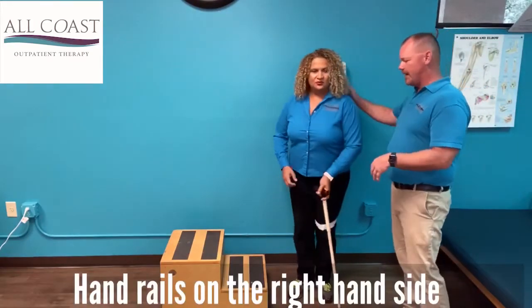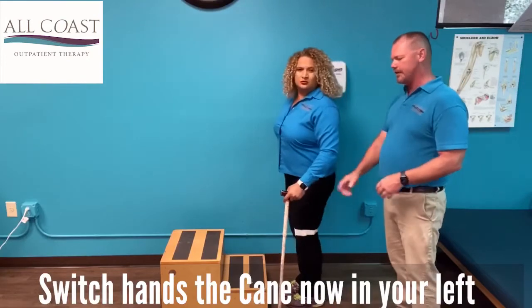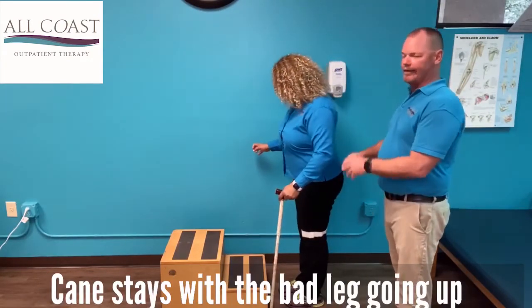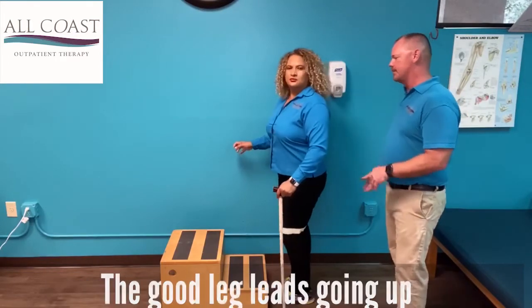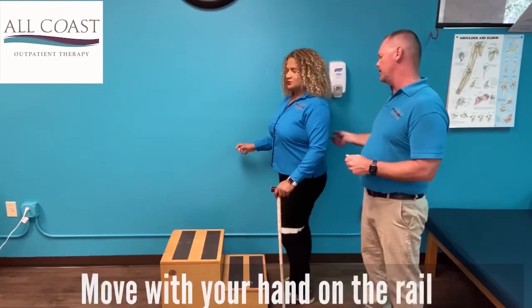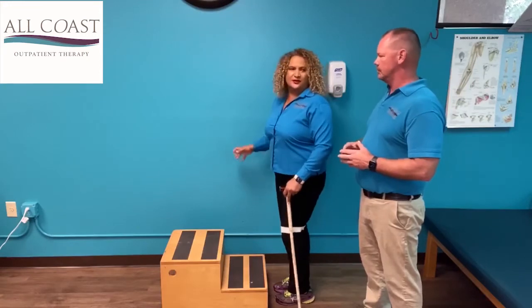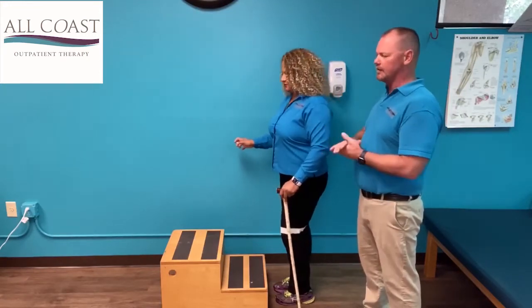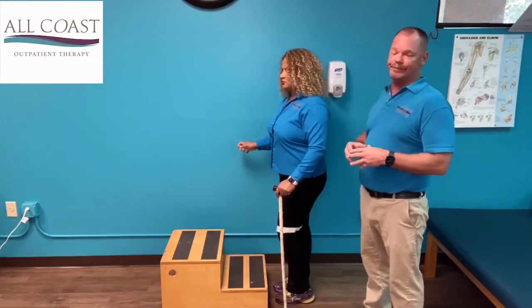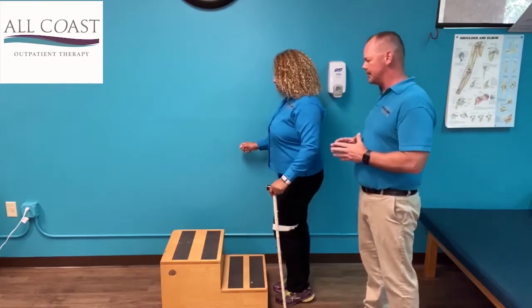If we switch to the handrail on the right-hand side, we're going to switch hands. Normally the cane would be in the right hand, but in this case we're going to put it in the left hand. The cane is still going to stay with the bad leg as you're going up, and the good leg's still going to lead — you're going to pull with your hand on the rail. This is the only time your cane would go onto this side — when you're using the handrail — because it's giving you support on both sides. It's just like using a two-handed device, so it takes away the need to have it in the opposite hand.